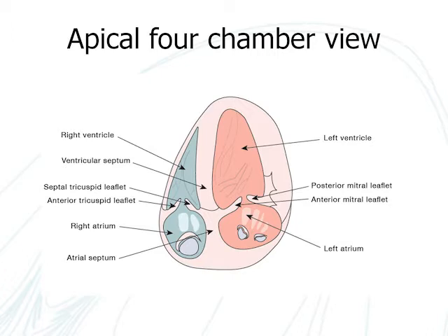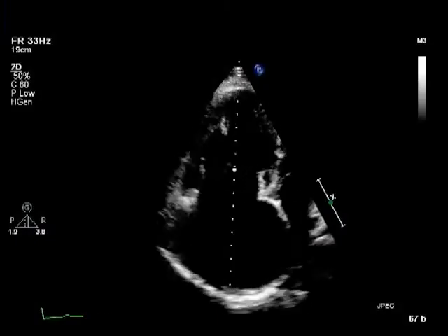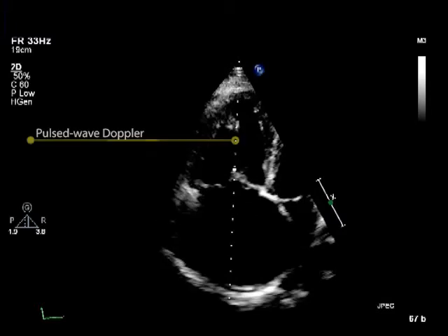Two different views are needed to determine the myocardial performance index using pulsed wave Doppler. Firstly, the apical four-chamber view is used to visualise the tricuspid valve and the tricuspid inflow pattern. This shows the placement of the pulsed wave Doppler cursor, which has to be parallel to the right ventricular inflow.